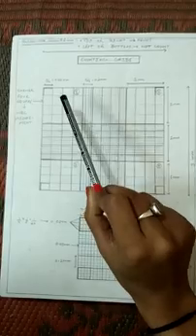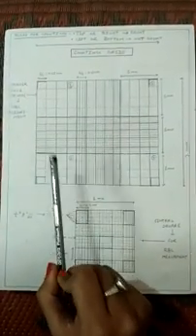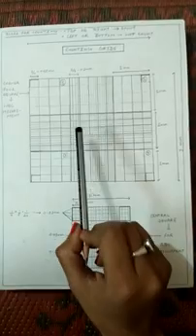So you can see 16 small squares in the four corner squares and 25 small squares in the middle square. This one is used to count the number of RBCs, and these four are used to measure the number of WBCs in human blood. So here 16 small squares and here 25 small squares are used to measure RBCs in this diagram.